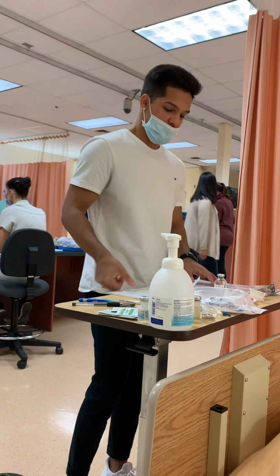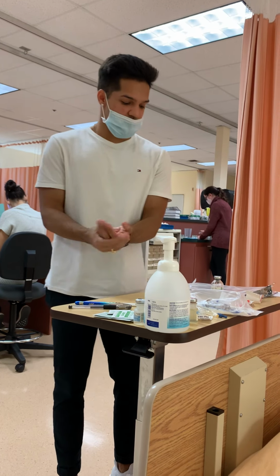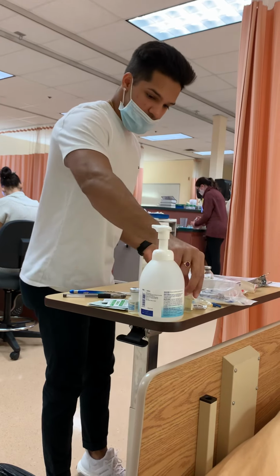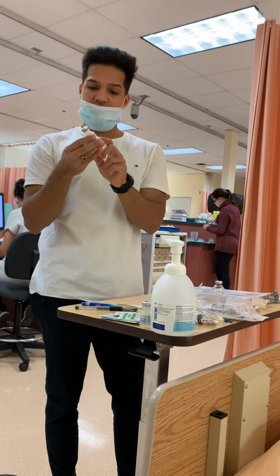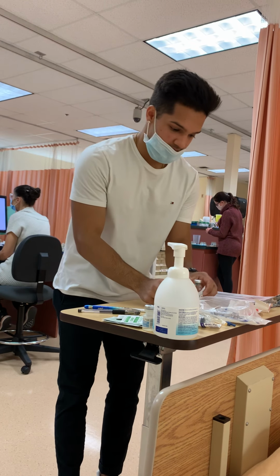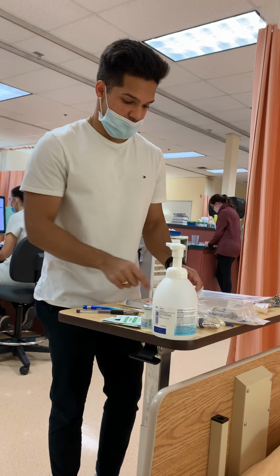The first thing I'll be doing is hand hygiene before I get the rest of my supplies. I'll be washing my hands. I'll be needing my sterile water. Here I have my sterile water. It's not expired or damaged, so it's good to use. Now I'll also be needing my 10 mL syringe, a blunt fill needle, and some alcohol swabs.